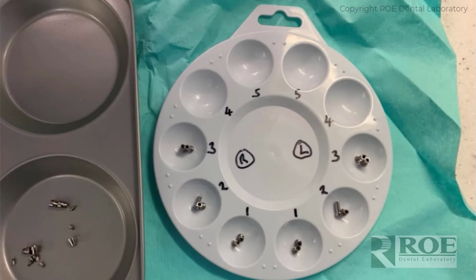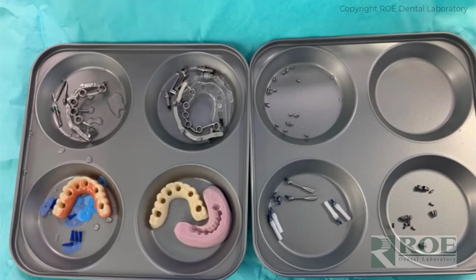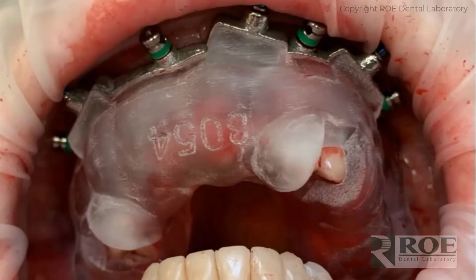This particular doctor had a technique which is very common to place the parts by a number in a number sequence. Of course, both work. We like to use the surgery mat simply because it does organize the parts all by the particular implant. But both work. So let's go through the surgery. This first part is going to be a typical Chrome surgery. The pin guide delivers the fixation base.